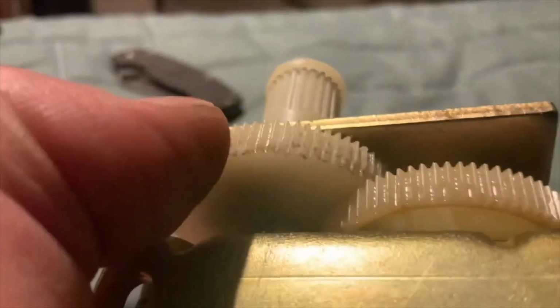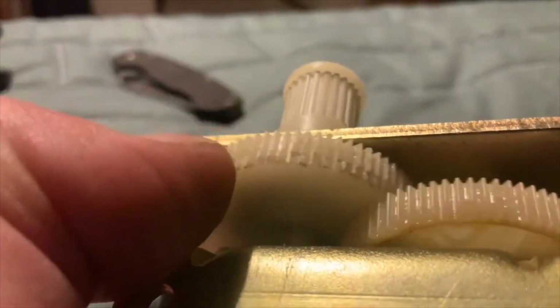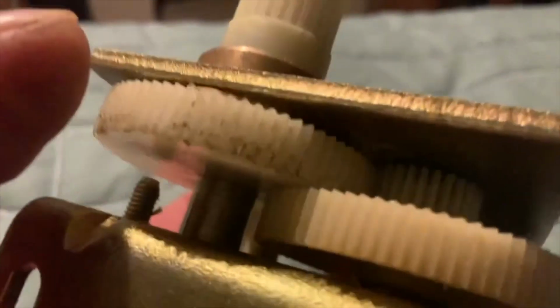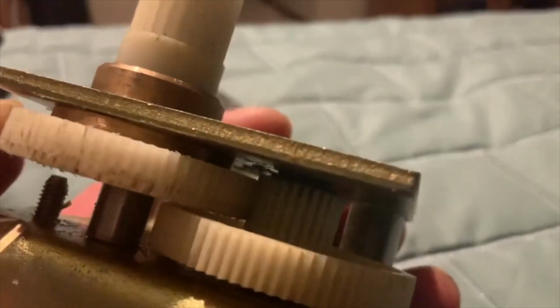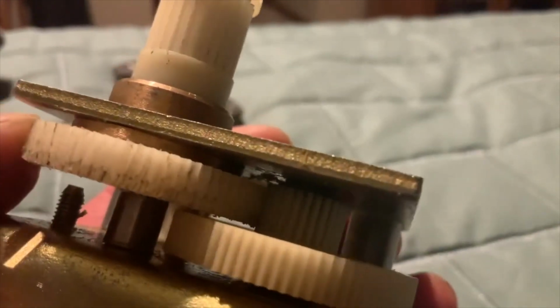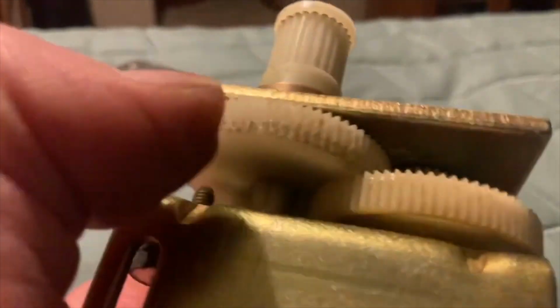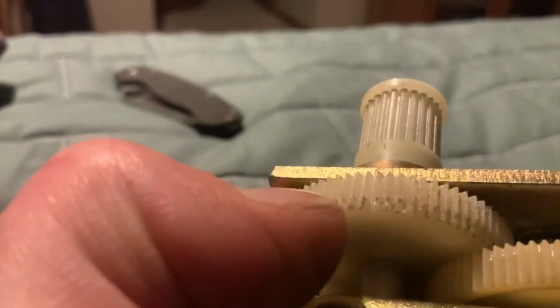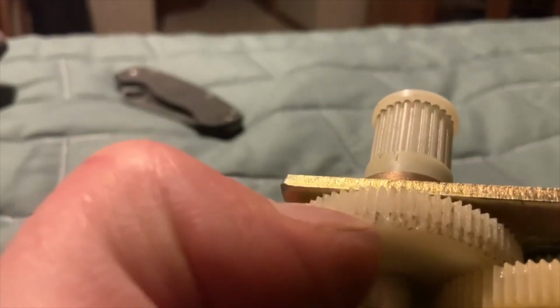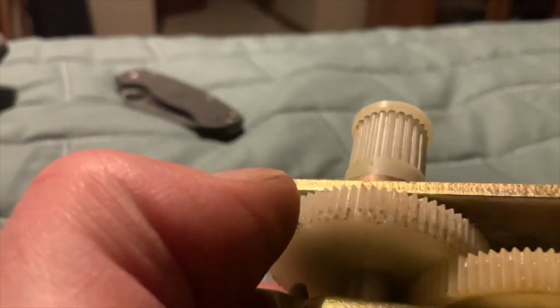Look at this. These grooves, this side of it that's black, was melted and flat, and it was making it hit against that cog in there. It was making it very difficult for this to turn. So I took a file and I filed the grooves. First I tried heat. That didn't work too well. Then I tried a knife. Ultimately I settled on a file.